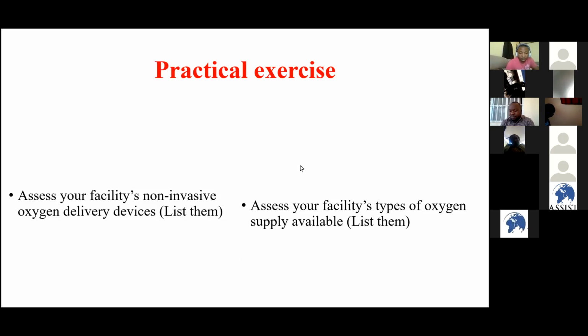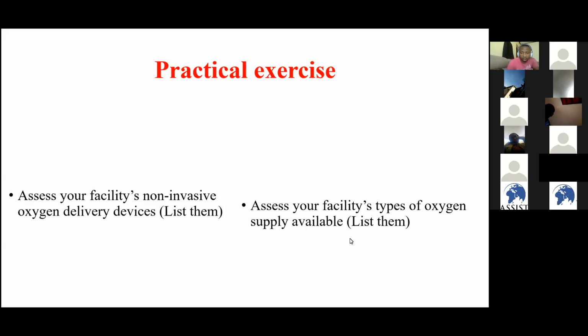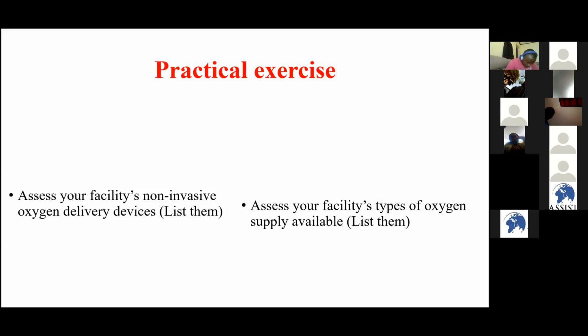If the reservoir is not full, the oxygen will not arrive at the patient, meaning that the 7 liters will not be enough to fill the bag. So when the patient is breathing, he's not getting the maximum oxygen, because much oxygen is going to the reservoir instead of going to the patient.